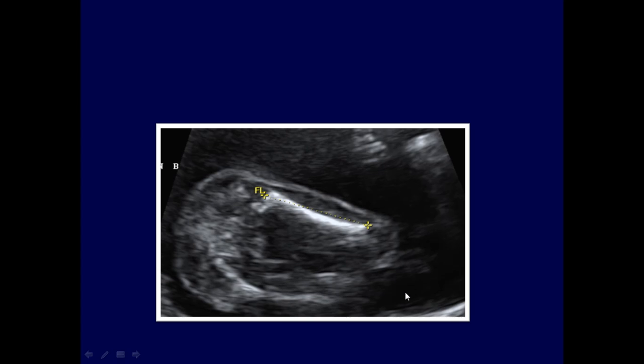This is the longitudinal section of the fetal femur. The longest section of the bone is obtained. Calipers are placed at the greater trochanter to the external condyle.